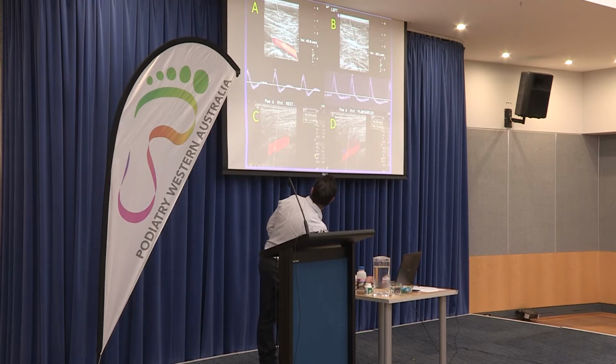And the other thing you'll see is the systolic velocity here, which is 90 centimetres a second, and the peak systolic velocity there is 260. My maths ain't that good, but let's say about 3 times. So there's a significant stenosis, and there's a lot of flow acceleration, given that the same amount of blood has to go through a vessel that size as through a vessel that size. If the same amount of blood has to go through the smaller space, it obviously has to go through faster.